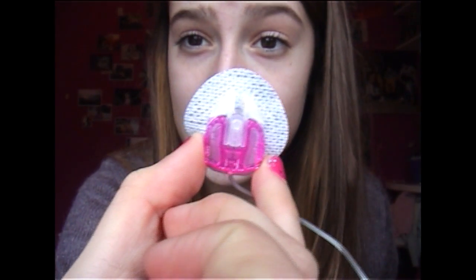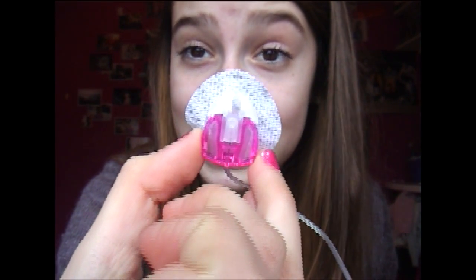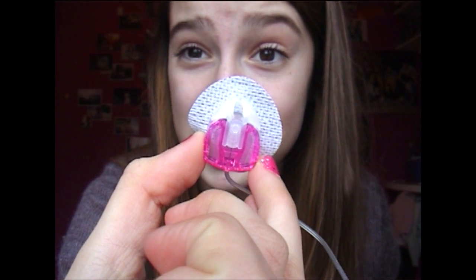This is what the set looks like — this is mine. Some people have different ones because I've got a Mio, but you can get sets in different shapes and sizes to suit your body.